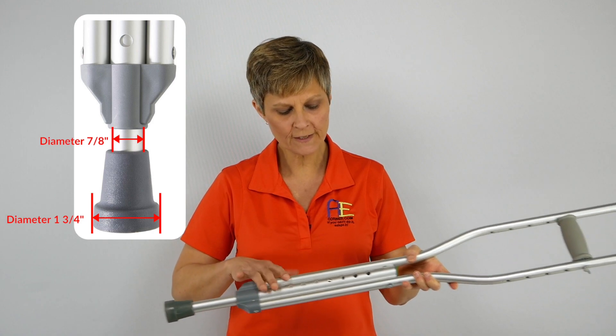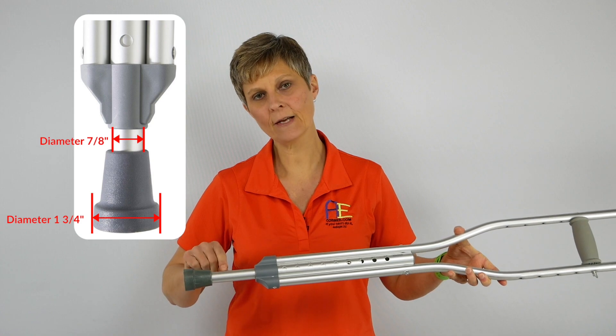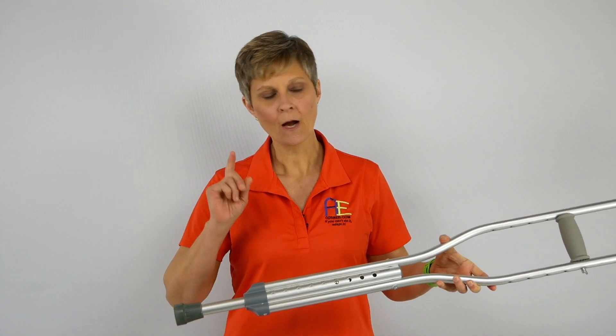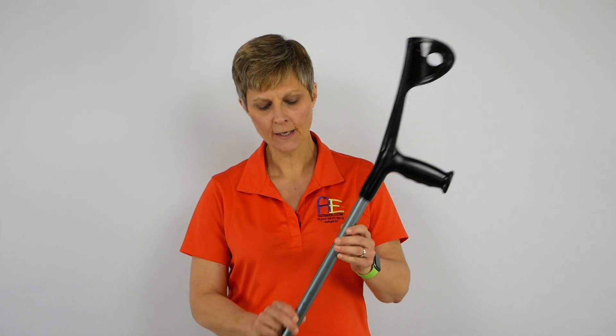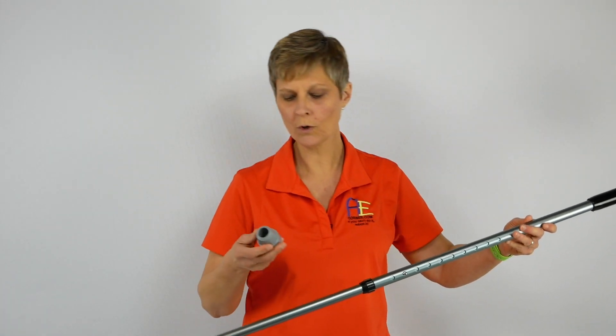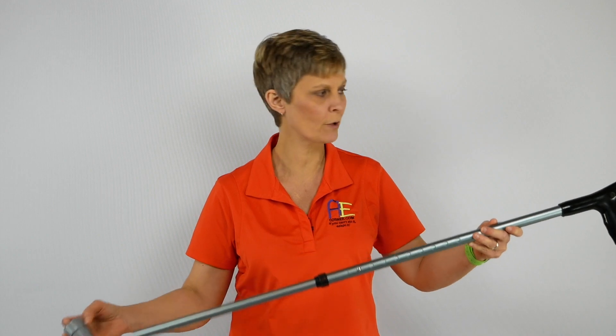Most of this type of crutch — the tube at the end — needs to be seven-eighths inches in diameter, and that's what this will typically be. I do want to bring to your attention though, I have what I call a forearm crutch right here and I tried it with this, and the tubing on the end is too small to actually work with the rubber tip they've included. So that won't work in the Crutch Caddy.